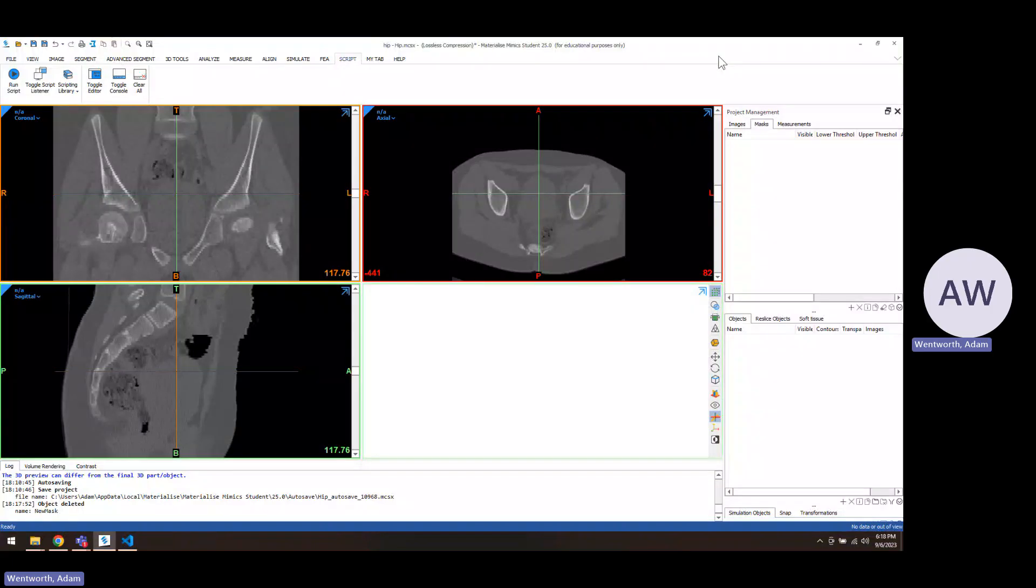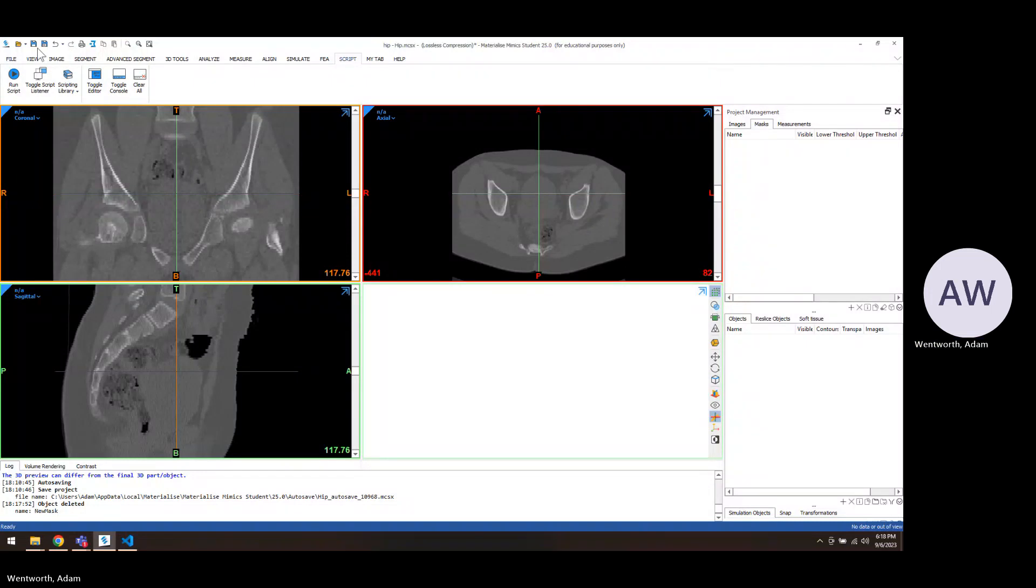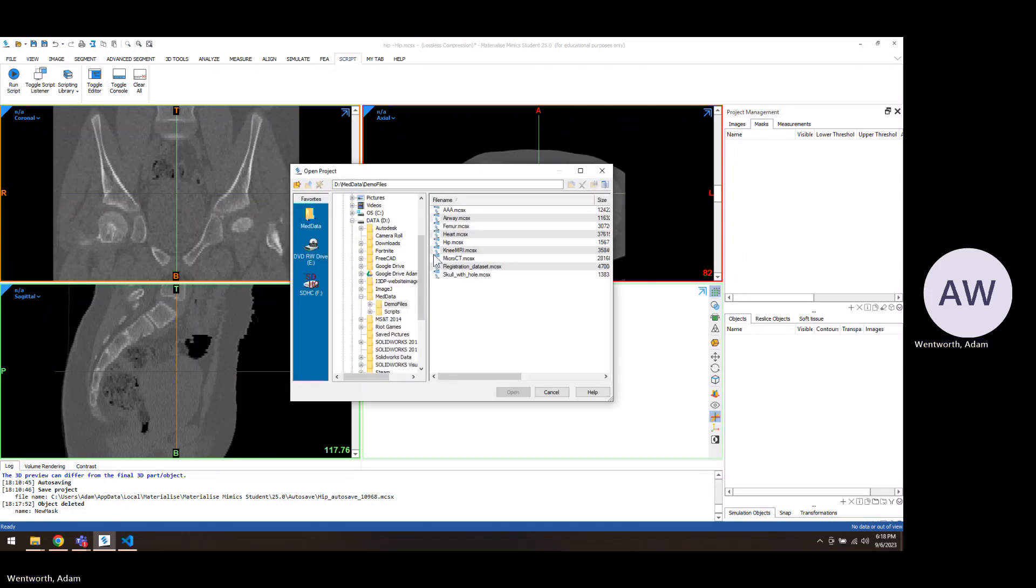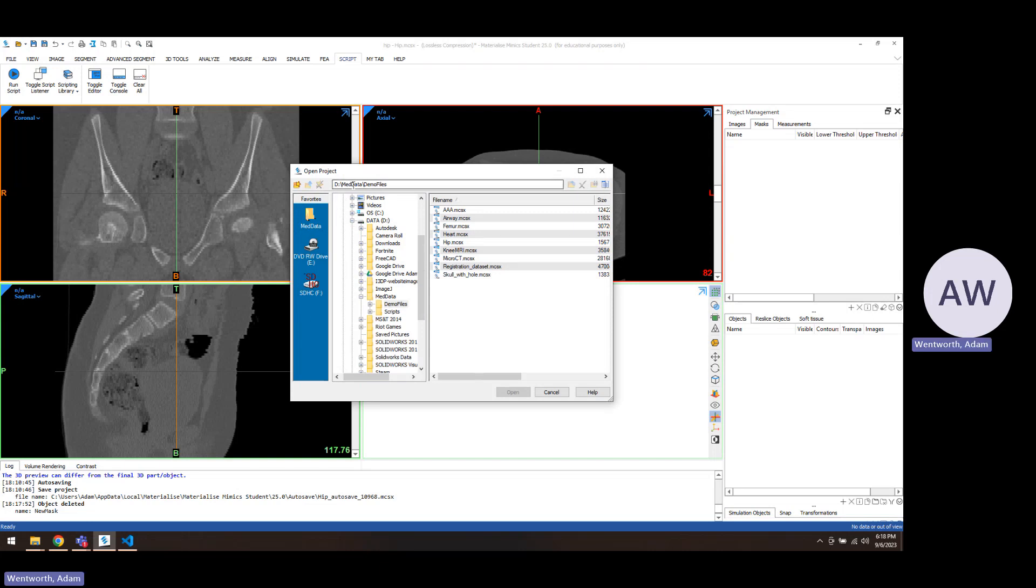Just to show you the basic steps of segmentation. We're going to start with the hip demo file, so you can get to that by opening it. It's going to be in your default drive where you installed it, something called meddata, and then demo files. These are the demo files that they routinely have, so we just picked hip out of the middle one.